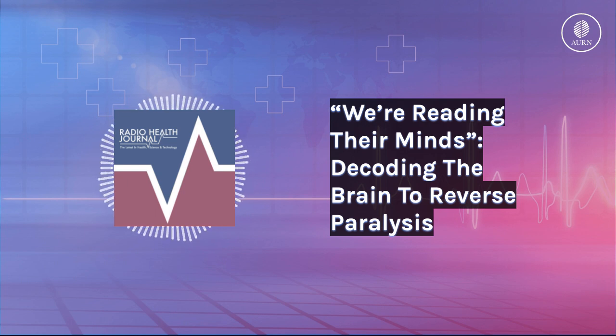And it's because we believe from a combination of spinal cord stimulation and brain stimulation that we've been doing with these special patterns that are based on things that we learned about his particular brain activity and patterns. Brain activity is different in each person. So even though Boughton was able to decode Thomas's brain signals, he has to start all the way over with each new patient to learn the exact language of their specific brain.